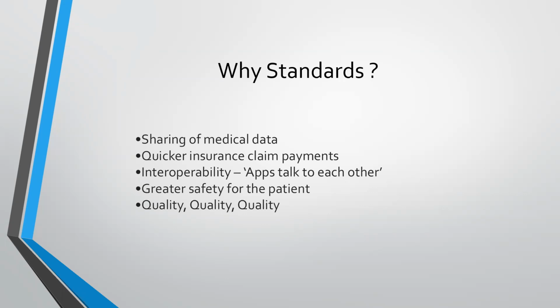So these kinds of things are there. It is not 100% foolproof, but every care is taken during the implementation process so that these kinds of errors wouldn't happen. That's where the standard excels, with greater safety for patients, and obviously, when we follow all of these aspects, utmost quality is delivered.